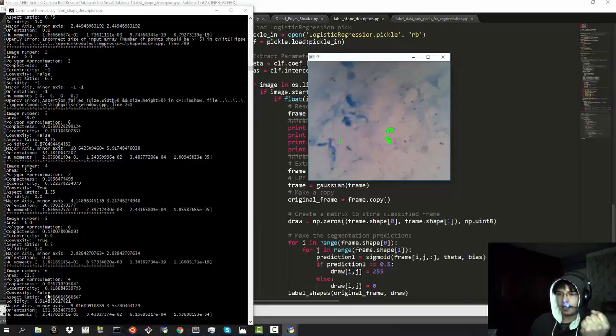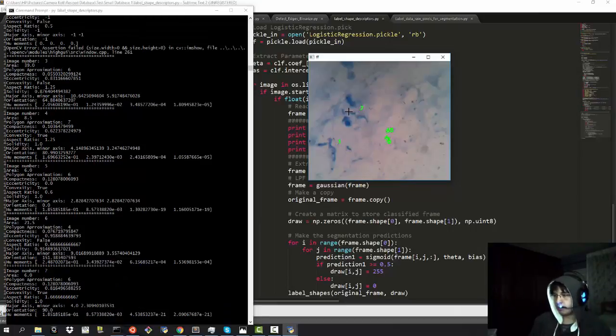And by the way, fuchsine precipitations have not really been studied by these other papers. I don't know why, but they seem to appear very often and to be confused with bacteria. But as I was saying, in this case the features and my region of interest suggest that this is a bacteria, so I'm going to classify this as a bacteria. And so we continue working with this program.